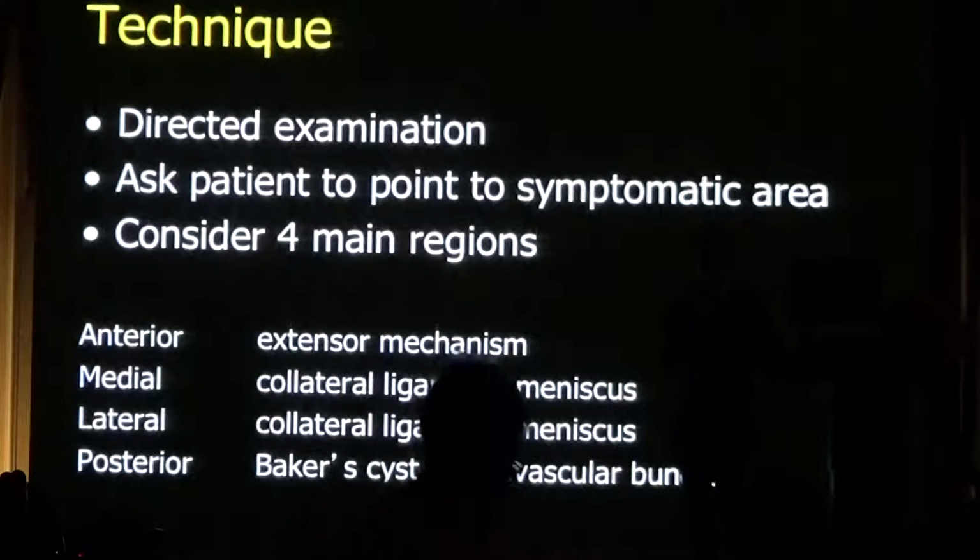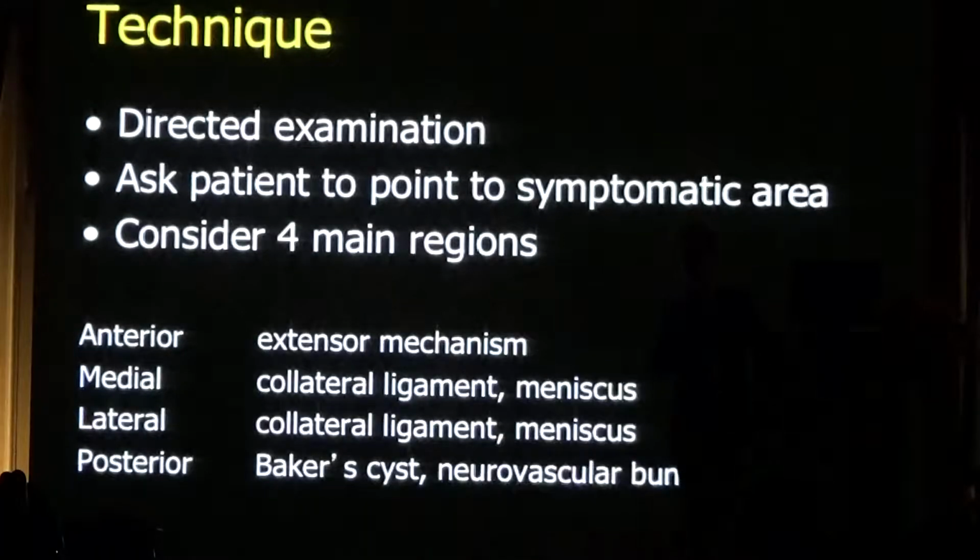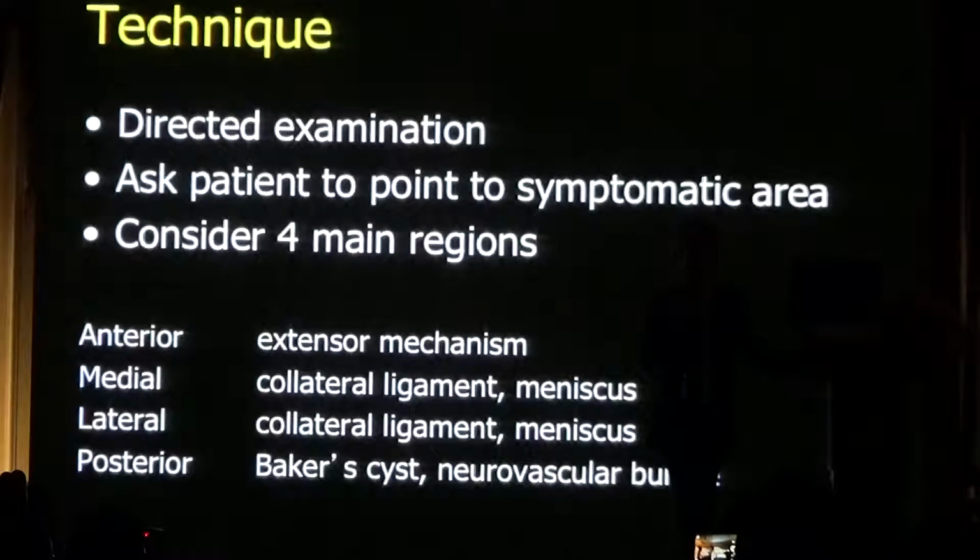In most circumstances, if I'm looking for internal derangement of the knee, I'm going to use MRI. We mustn't forget the role of the plain film as well. X-rays are extremely important. But there are many occasions where ultrasound is an appropriate examination to perform.